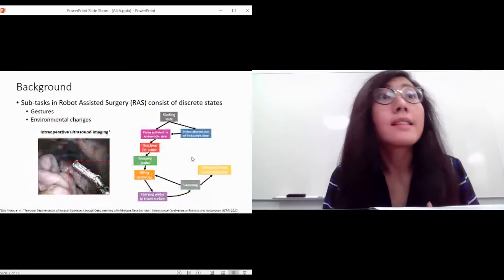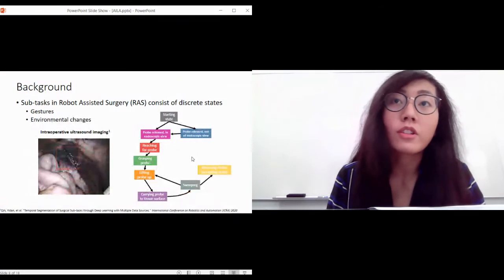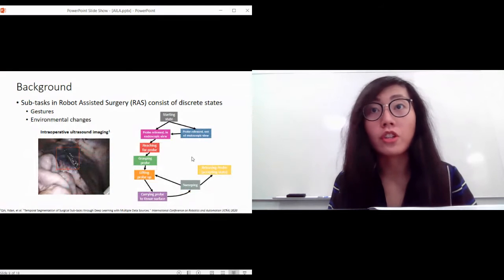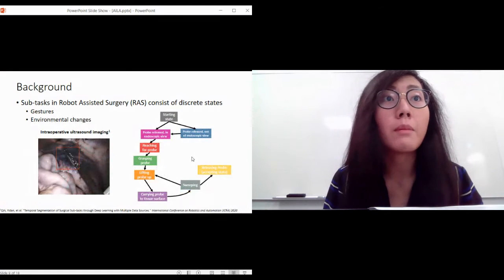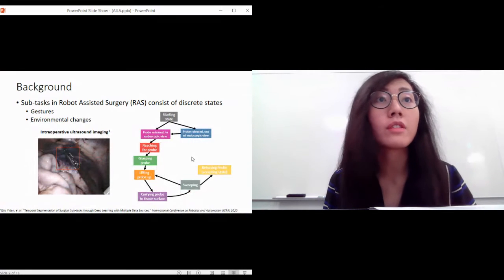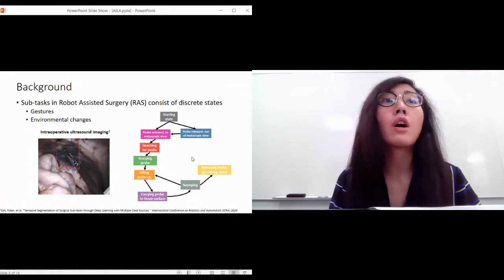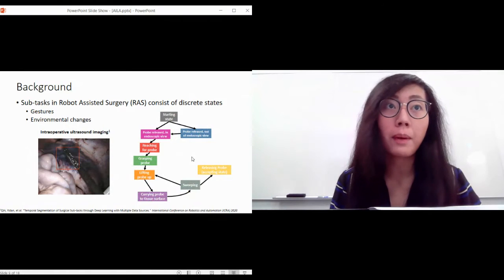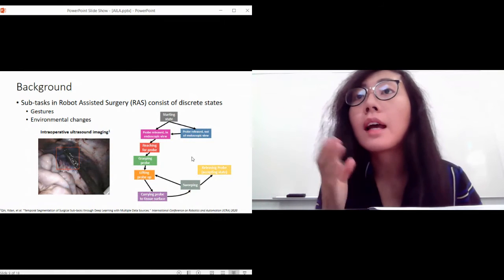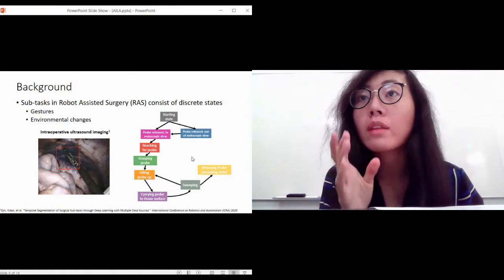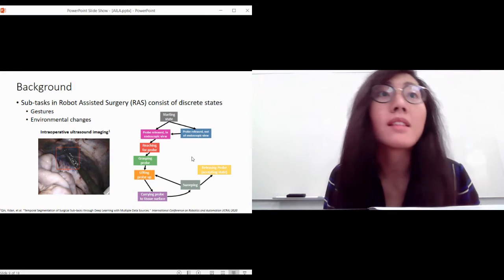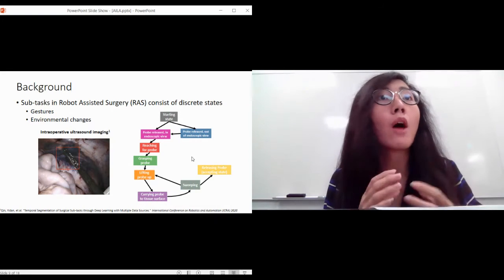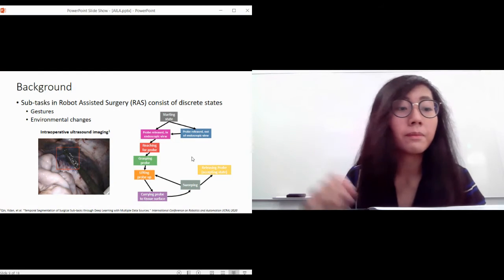This state doesn't need to be a gesture performed by the surgeon, it can also be environmental changes. For example, this is intraoperative ultrasound imaging, a very common task performed by Da Vinci surgeons to use an ultrasound probe to scan the underlying anatomical structure of the patient. When the probe is released, whether or not it is in the endoscopic view has nothing to do with the surgeon's gesture but rather is an observation of the current endoscopic environment.